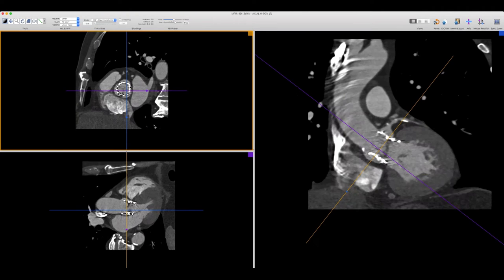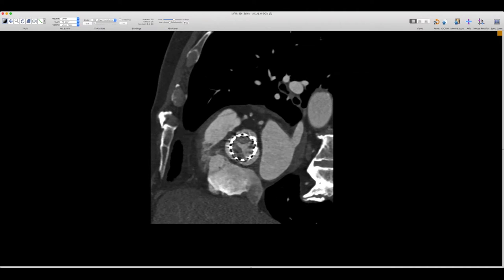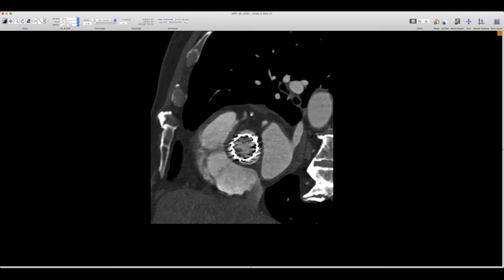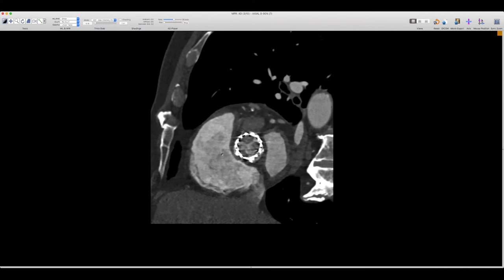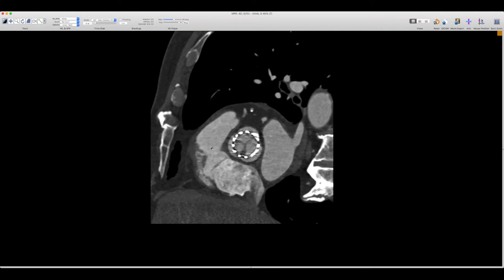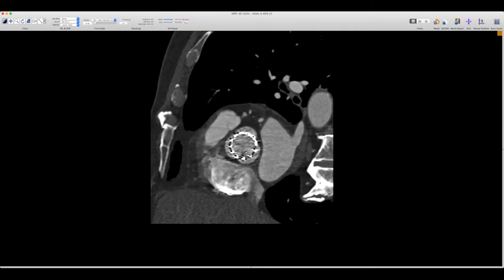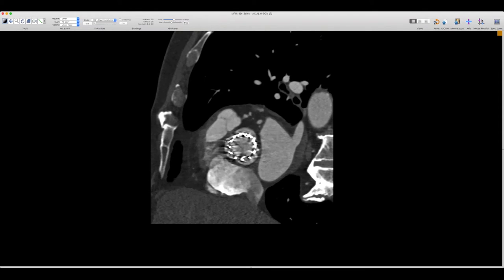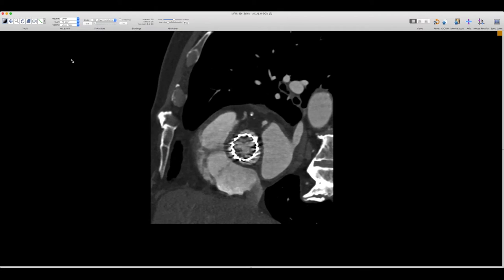I'm going to show you the double oblique view here down the barrel of the valve, and you can see that basically all the leaflets are thickened. This is now called hypoattenuated leaflet thickening, or HALT, in TAVIs, and this is assumed to be thrombus, and it responds in general to Coumadin. A lot of these patients are not on Coumadin to start with, and they're put on Coumadin after this is found. This tends to resolve. So this was HALT, hypoattenuated leaflet thickening, and HAM, which is the same with restricted motion, causing motion restriction of the leaflet. So this patient was put on anticoagulation with warfarin, and we'll see what happens, but just another case of TAVI thrombus.